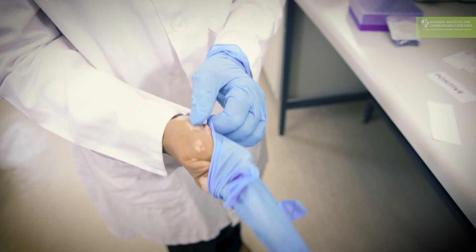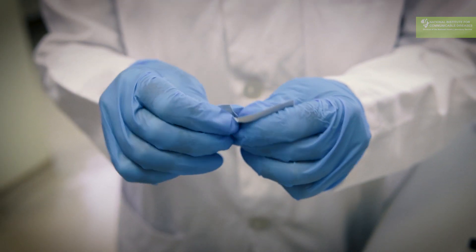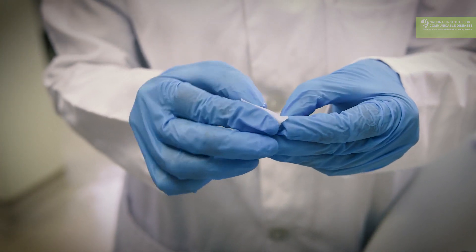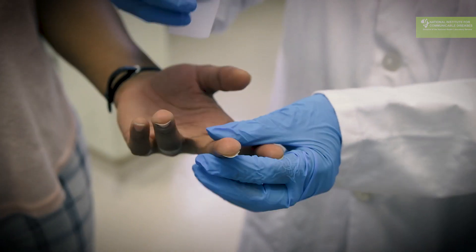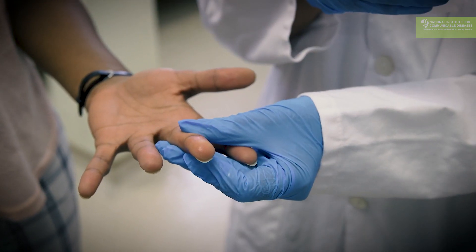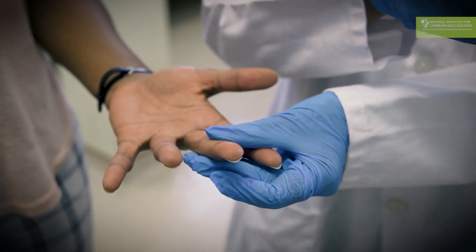To start the test, first ask the patient which hand they use and use the non-dominant hand. So if the person is right-handed, you take the sample from the left hand. Once you've selected the non-dominant hand, select the finger — you can use the middle finger, index finger, or ring finger. Once you've selected the finger, clean it using the alcohol swab, moving from mid-finger in one swoop over to the fingertip. Let the finger dry and then get the lancet ready.